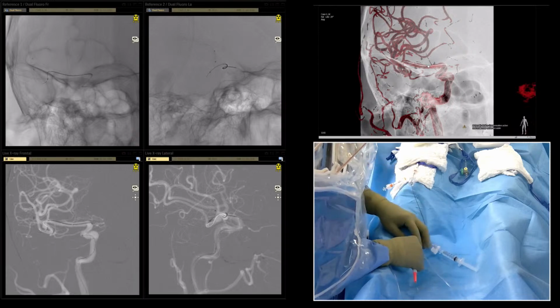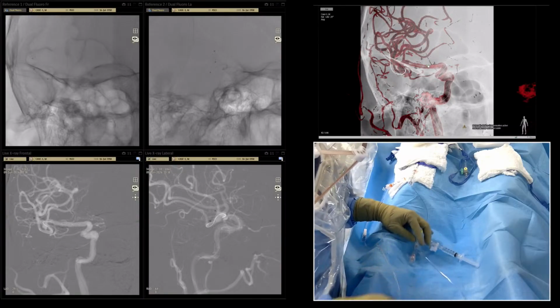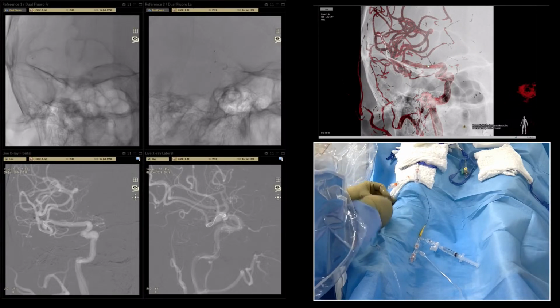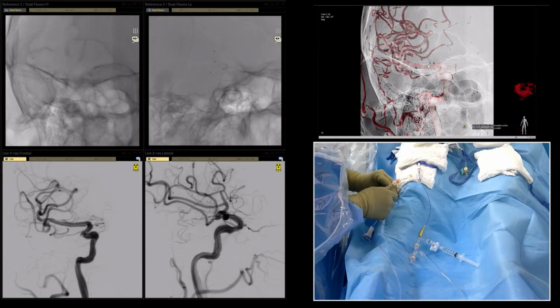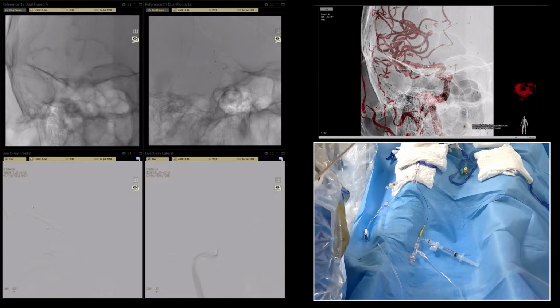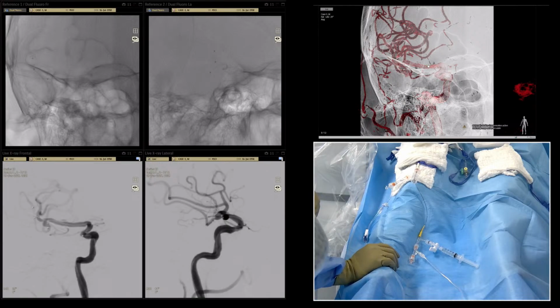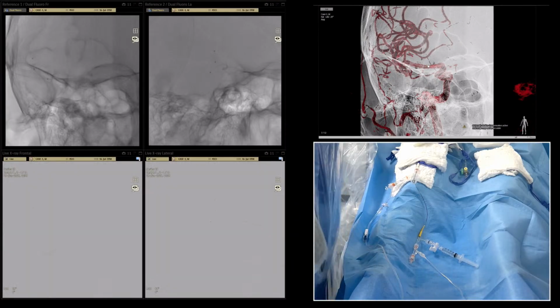Now we change the anatomy completely. I will ask Roland to put the Chikai black inside the Gamma. Okay. Yes, and now the 3D roadmap is no more actual till we replace, till we little bit release the tension in the Scepter. Yes, everything is clear. No extravasation I've seen.